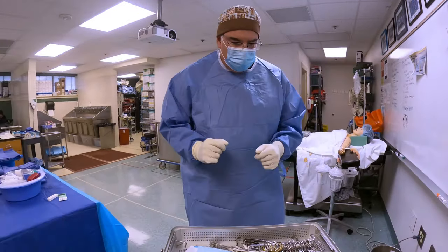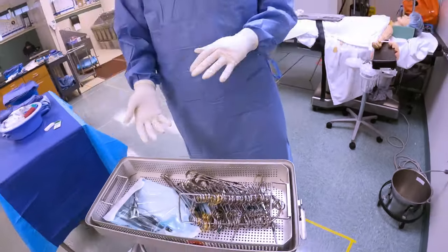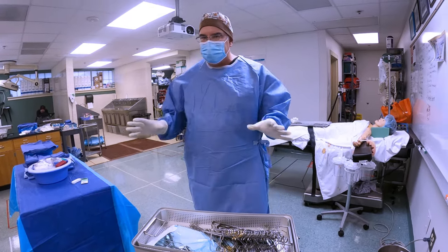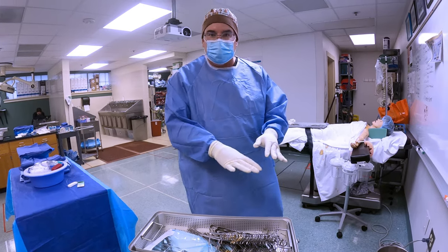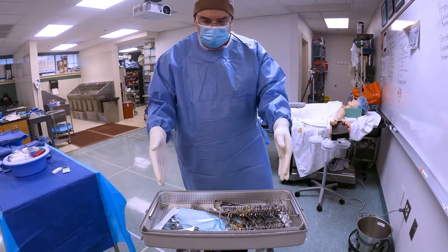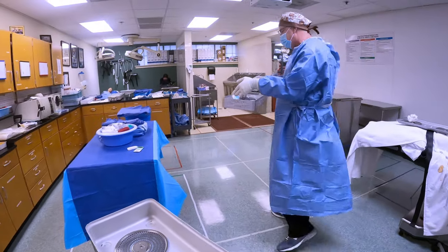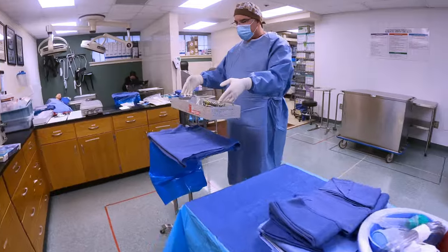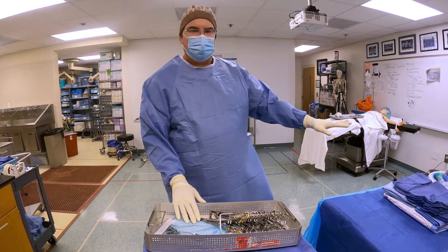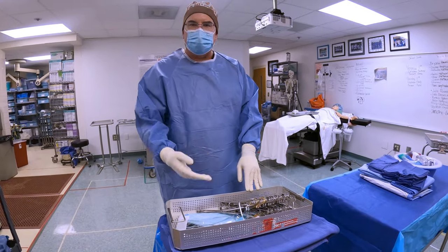I can re-glove when my circulator gives me a new pair, but everything underneath still remains sterile — and that saves me from having to completely break down and re-scrubbing, gowning, and gloving again. So now that I have my second pair of gloves on, I can deal with my instrument tray. Again, I can see that the indicator has turned, but if I couldn't see that — if it was flipped over or covered — what I would have to do is deal with this in such a way that I could check that indicator without contaminating a whole bunch of things. So I'm going to pretend I cannot see it. I'm going to reach straight in and pull up, have my circulator check the filters, and then bring this over and set it onto my mayo stand.